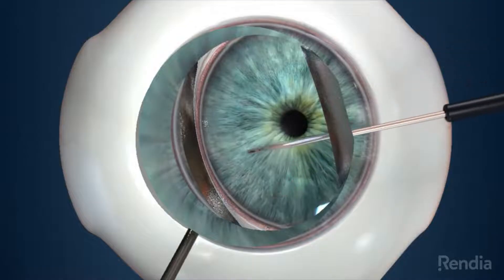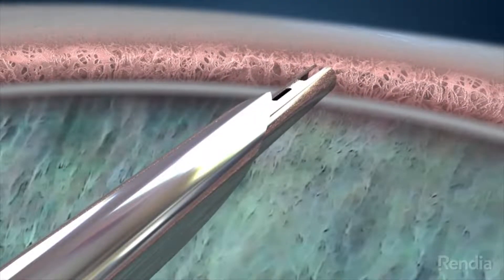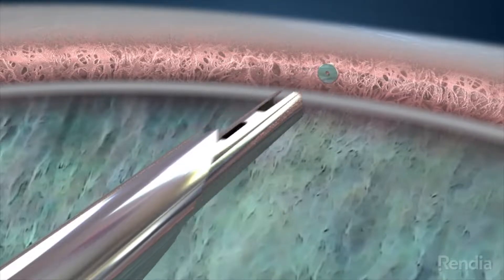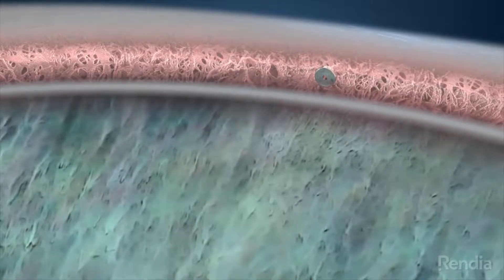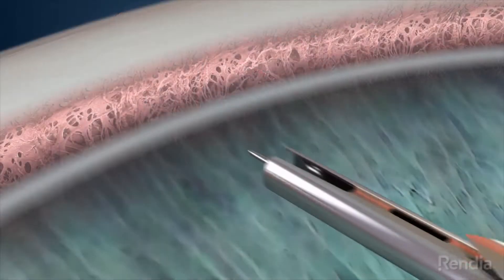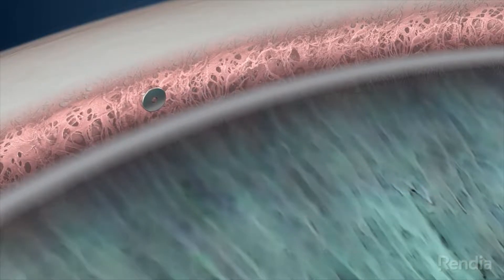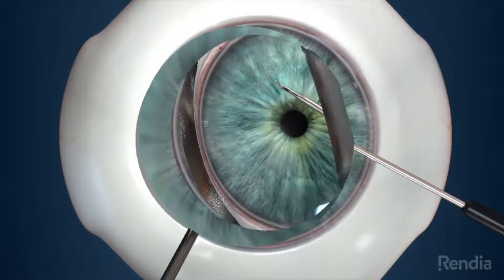The surgeon then moves the inserter slightly to a second location and a second Eye Stent Infinite is placed, creating a second pathway for fluid to drain. Then the surgeon moves to a third location and an additional Eye Stent Infinite is placed, creating a third pathway for fluid to drain. The inserter is then withdrawn from your eye.